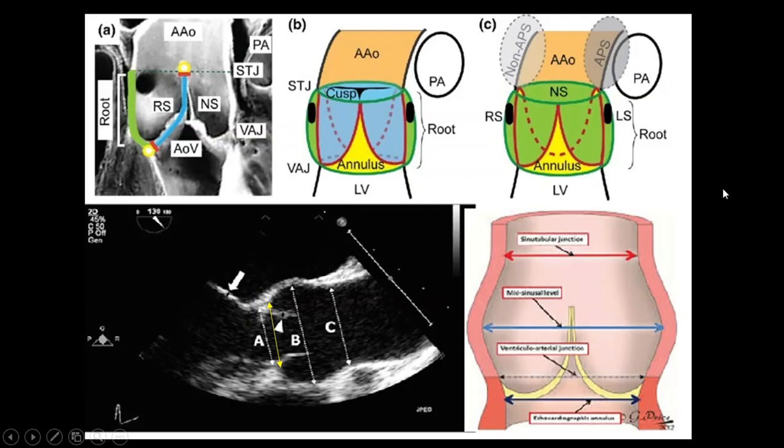As you know, actually, the aortic root has 4 diameters, not 1 diameter. The aortic root is a part of the aorta, the beginning of the aorta that contains the aortic valve. As you see here, this green is the aortic root, from the beginning to above the coronary sinus, connecting to the end of the aortic cusp here.